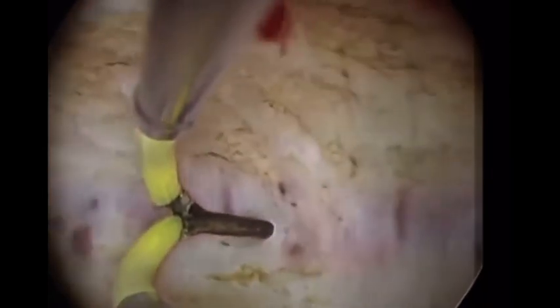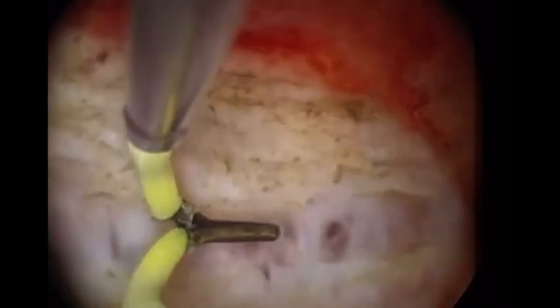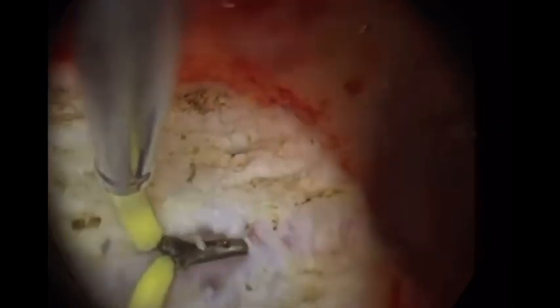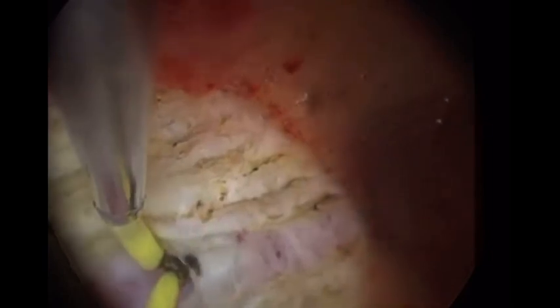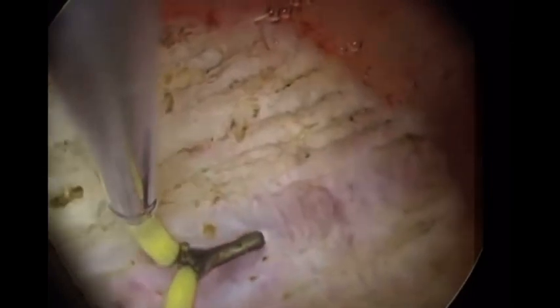Here is the secret: the cutting element in this surgery is not the monopolar electrode — it is the fluid pressure. Just give a lead to the cut by making a small touch, and then fluid pressure will continue cutting into the proper plane, into the path of least resistance. This guarantees you are exactly in the middle. The most important factor is to achieve equal retraction anteriorly and posteriorly. The septum is a bulk of muscle stretched between the anterior and posterior wall — embryologically, these fibers should have migrated up and down, leaving a normal cavity.